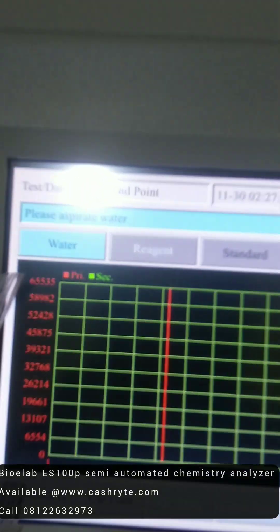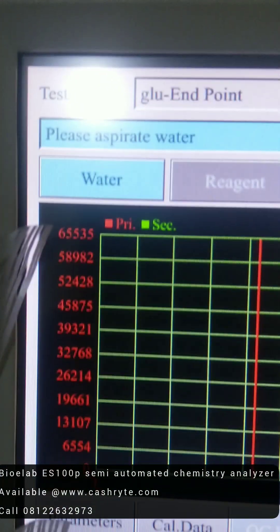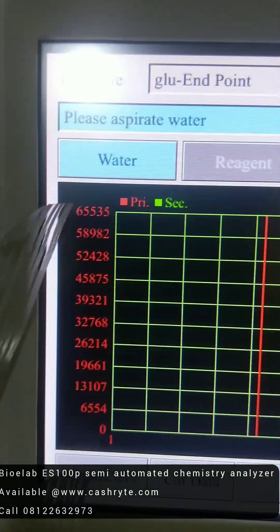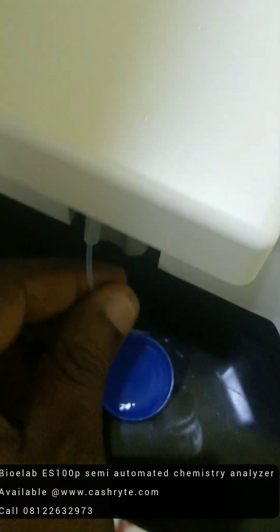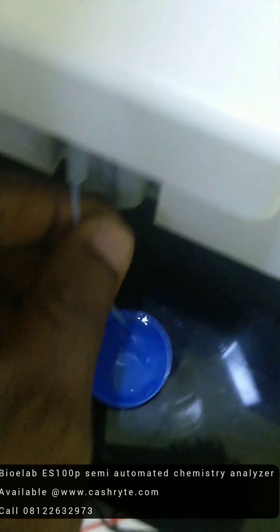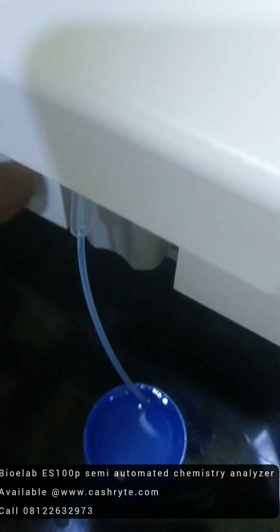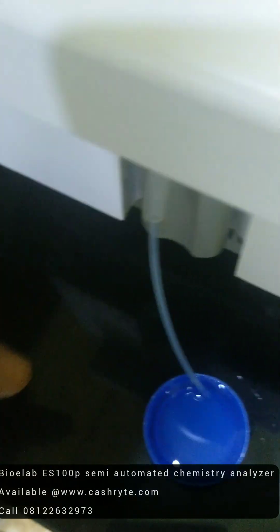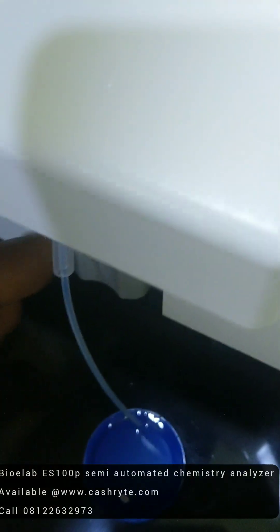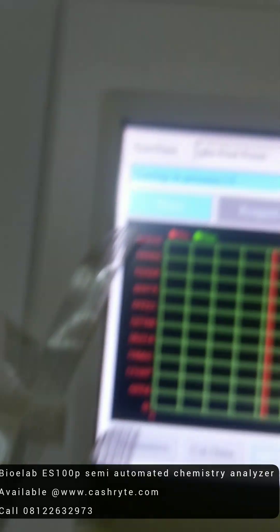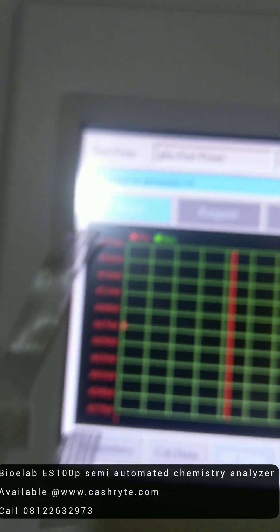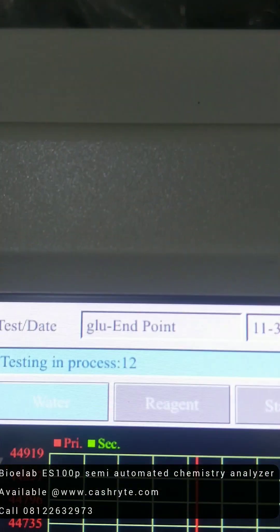It goes to the glucose log. So it's ready to aspirate water. Yes. So you come here, you click on the aspirate button. So you hear it. So it does aspirate. Pump aspirate.